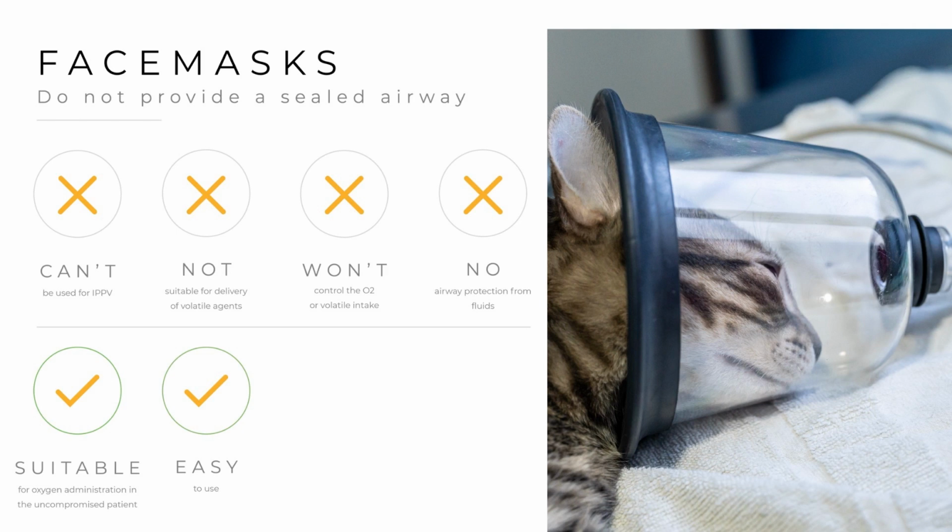This makes them unsuitable for providing IPPV, as you cannot get positive pressure and force air into the lungs. They are not suitable for volatile gases, as there is no gas seal to prevent environmental contamination. Equally, you cannot control the amount of anaesthetic the patient is receiving, as too much agent is allowed to leak into the environment. And as there is no fluid seal, they will not protect the patient's airway against any fluids.